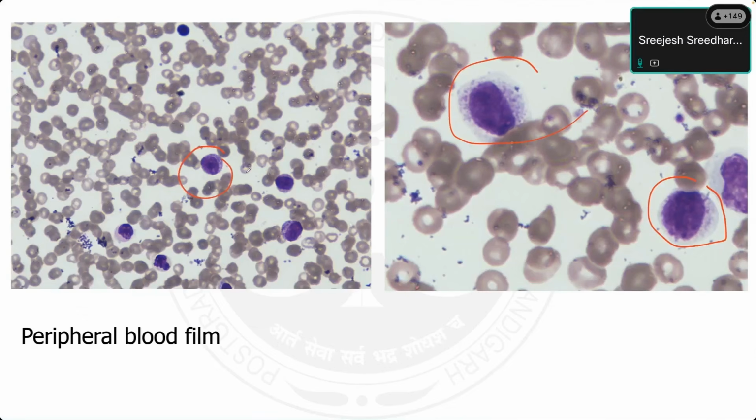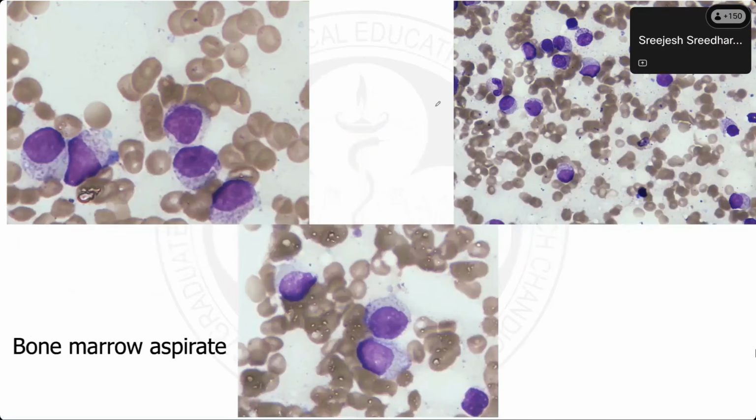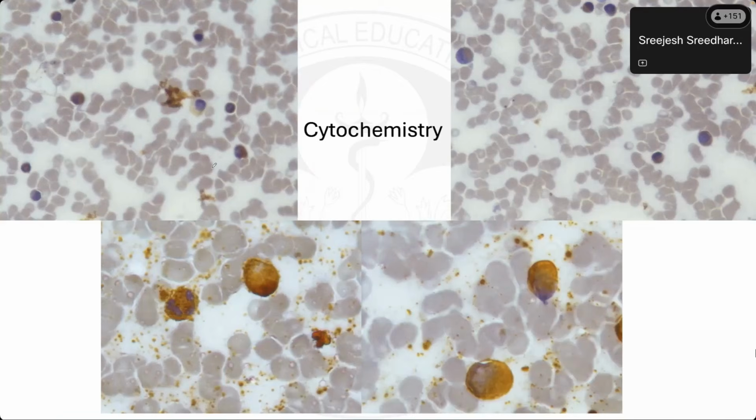Bone marrow aspirate. The majority of the cells were these cells, all with eccentric nucleus and granular cytoplasm. Not a classical abnormal promyelocyte, but there was a suspicion that this could be a promyelocyte and this could be APML, right? All the cells were like this. MPO, strongly positive. Biopsy.